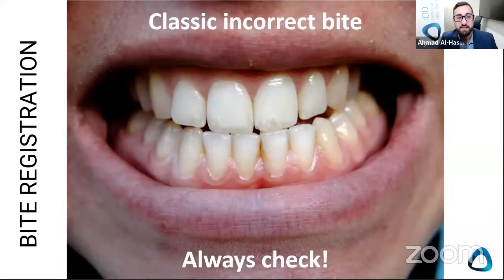The classic thing is make sure the patient is biting properly. When they're numb and they're tired and they've been horizontal for a long time, patients oftentimes protrude. Just always check that. Don't go in full autopilot mode. What I like to tell them is make sure you're biting on your back teeth. Bite hard on your back teeth. They bite on their back teeth. I check it and I take the scan.